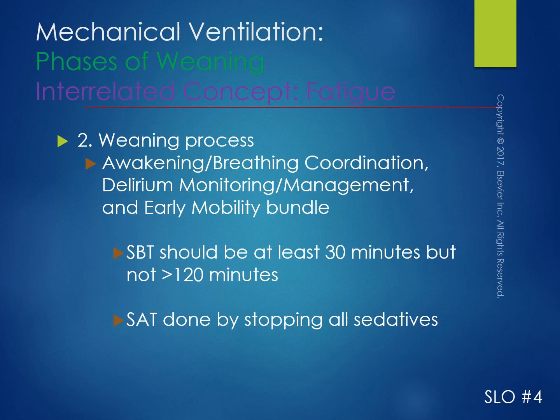Okay, so if they pass during the pre-weaning phase, we can go ahead and move to the weaning phase. So with this, we do a spontaneous breathing trial. So for 30 minutes, the patient is maybe just on a pressure support mode, or however the respiratory therapy or physician deem the ventilator mode, but it's just providing minimal support. We're watching them for those 30 minutes to make sure that they're able to breathe on their own.